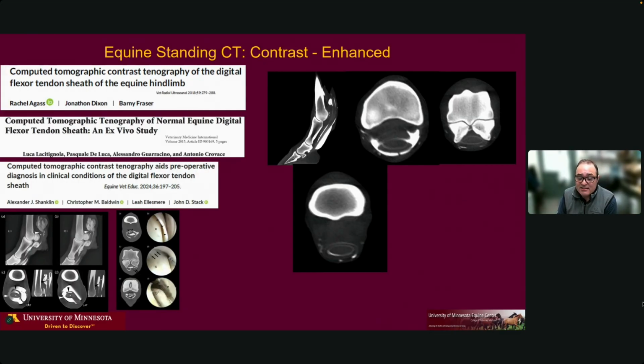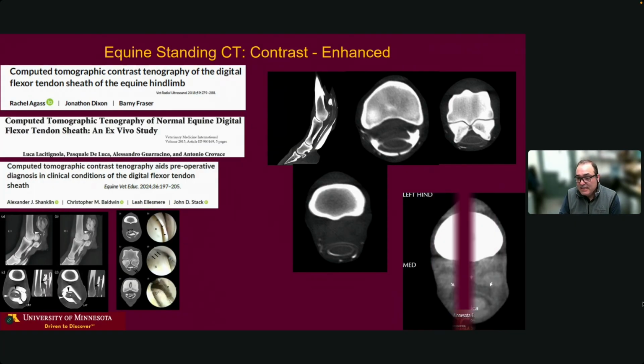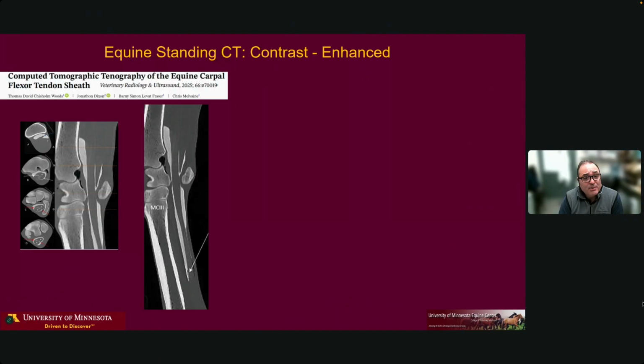And these are images of a case that I had, and you can see that it has quite a good image and detail of the structures being imaged when you put some contrast in these tendon sheaths. And this is a case where you can see how there's a tear on the manica flexoria. So with good imaging, you're able to get soft tissue diagnoses. And if you have any concerns, you could always go back and either think about contrast or complementing it with ultrasound.